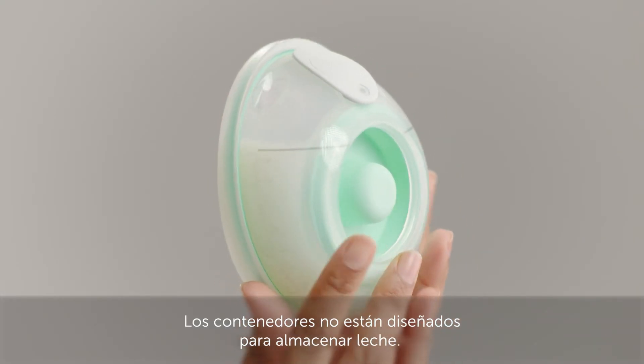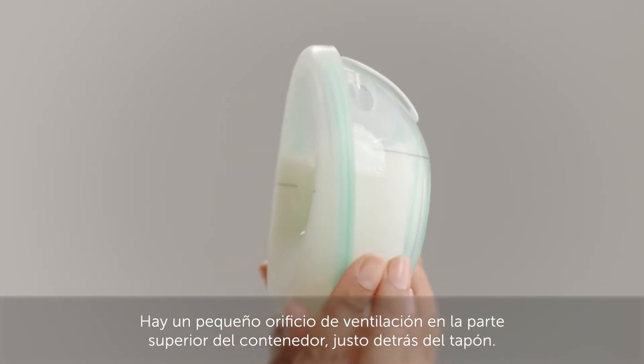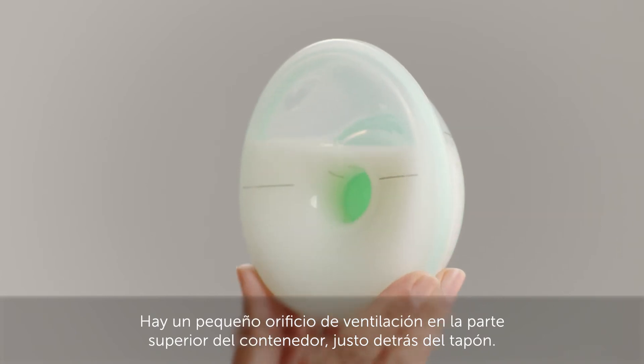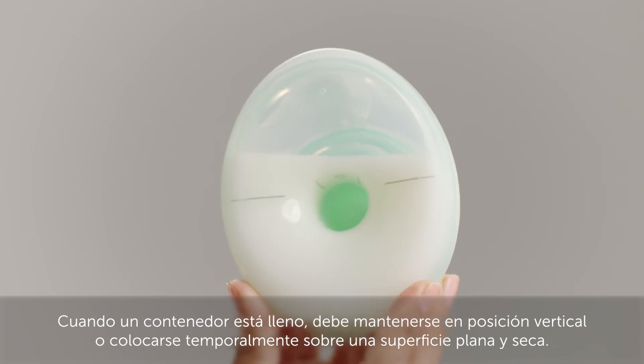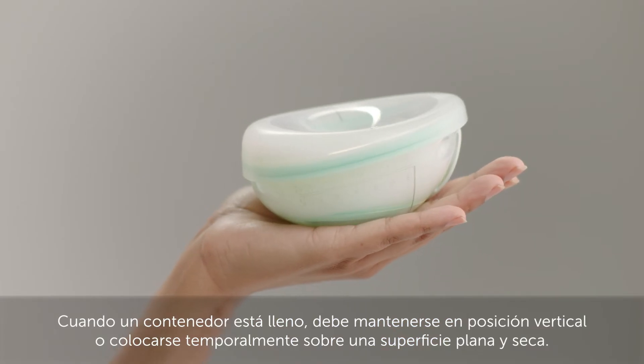The cups aren't designed to store milk. There is a small breather hole at the top of the cup, just behind the stopper. Once a cup is full, it must be held upright or laid on a flat, dry surface temporarily.